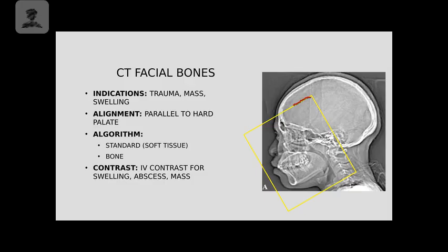We are wanting to image all the way out anteriorly on the face, and then we come back usually to about the ear, and we go all the way up to make sure that we include our frontal sinus. So we come up a little bit further than the top of this frontal sinus. As you might notice, this patient's laying a little bit differently. Instead of laying flat on their back, this patient would be laying on their belly, and their head and their chin are extended out.